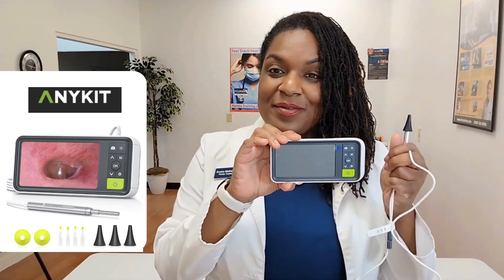This is the digital otoscope camera from AnyKit. It consists of two different components: the otoscope, which we will connect to the actual camera, and the camera itself.